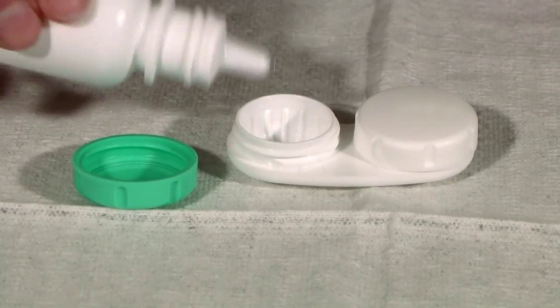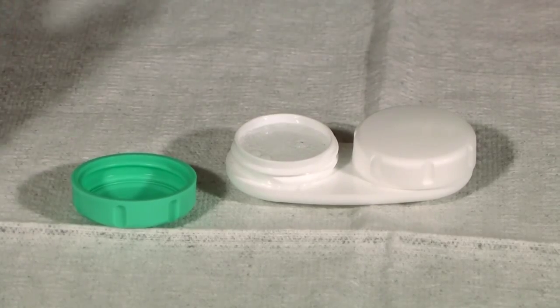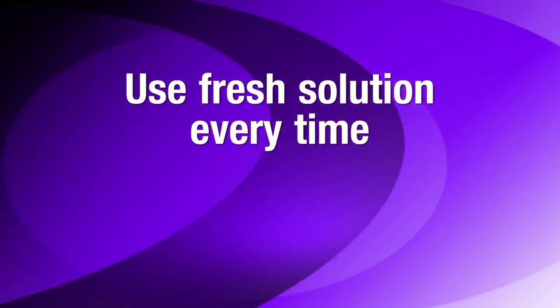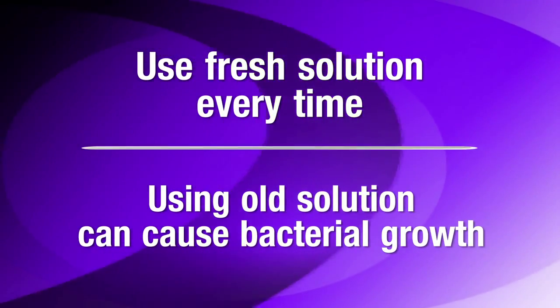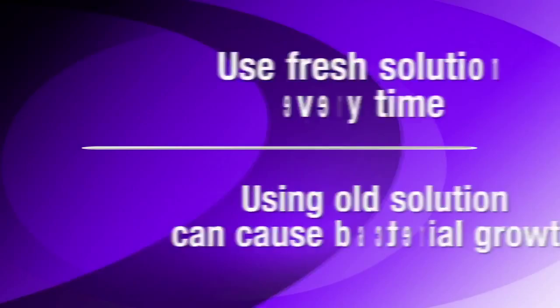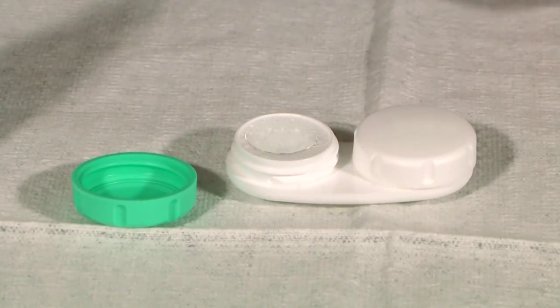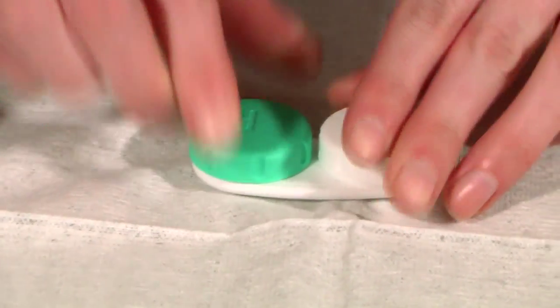The scleral lens now needs to be stored. The solution that fills the case is designed to wet and disinfect the surface of the lens, keeping your lenses comfortable and safe. It's imperative that fresh solution is used each and every time the scleral lens is stored. Using old solution, or topping off the solution, can create an environment teeming with bacteria. After filling the case with fresh conditioning or wetting solution, simply place the right lens in the side labeled R and place the left lens in the other side. Now you can store your scleral lenses overnight and they'll be ready to wear the next day.